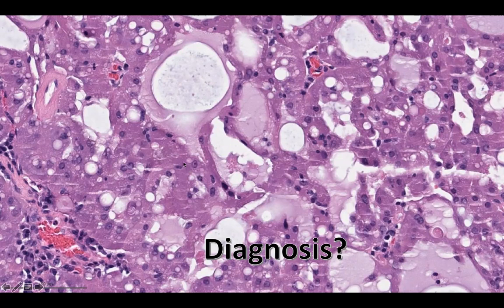The one thing is that these are all one cell type. Mucoepidermoid carcinoma, I'll show you, has 3 different cell types. But that's certainly on the differential for this. So that's not a bad thought at all. But I'm glad you're not taking my job tomorrow. Anybody else? Secretory. Yes, secretory, nice. Well done, Troy. Yes, this is secretory carcinoma.